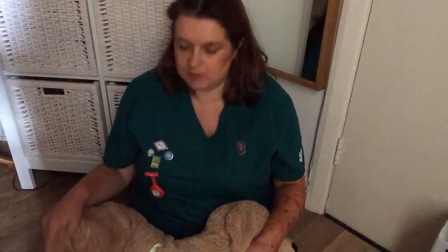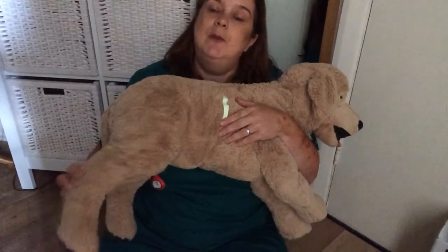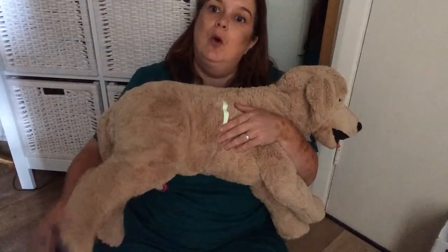It's quite a good one to remember with extremities because obviously we don't have bony landmarks, and this dog has got quite a decent leg. But it is common for people to get mistaken with the hock because the foot is so much longer down from the hock.